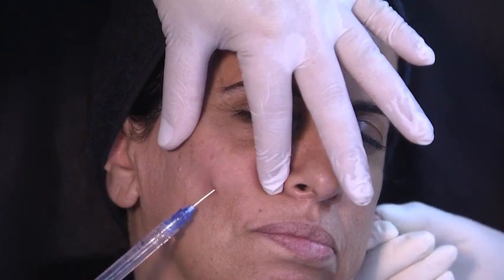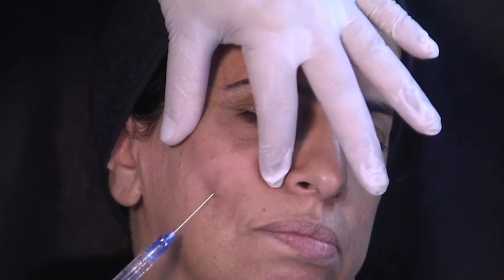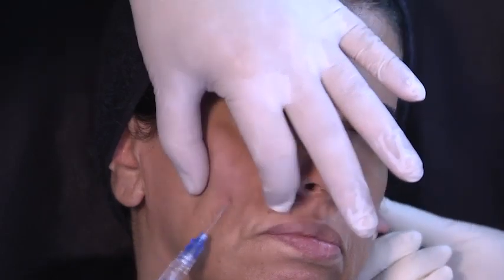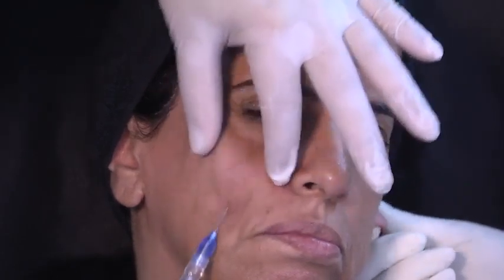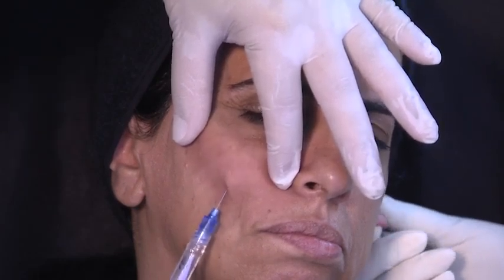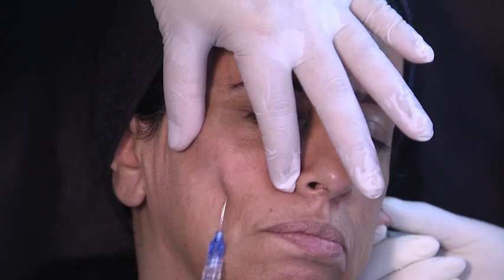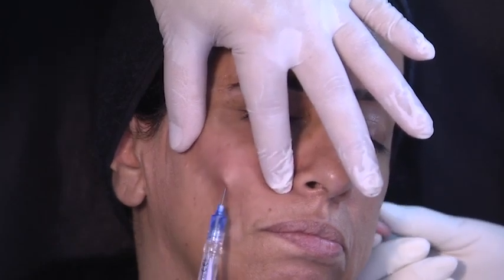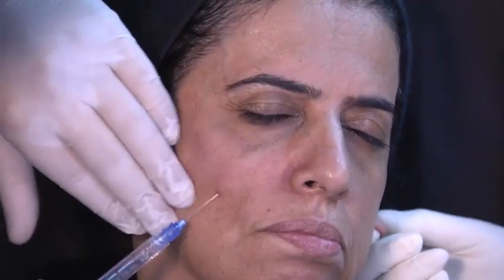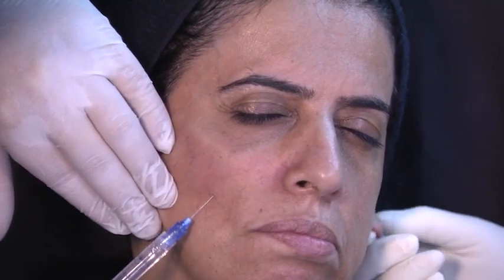So from the same entry point, I am going to go with the same technique, pinch the skin. I try to use the same hole, entry point, I'm in, but now look, I am going to go superficial. And when I say superficial, I'm subcutaneous. This you can only do with a cannula. We're using a 25G cannula. And very slowly, with only 0.5, I am going to help this skin to increase the thickness, to have a better hydration and moisturizer effect, to improve the fine lines with less quantity. Of course, we can keep doing the deep layer, but I think this is a nice way to do it.